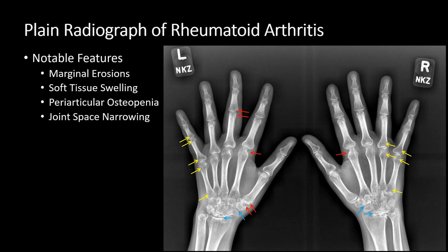Notice how the bones look more lucent right around the joints. This is present throughout both hands, but just a few arrows are shown. The blue arrows represent joint space narrowing, involving many of the carpal joints, though this is not as severe involving the joints of the hands.